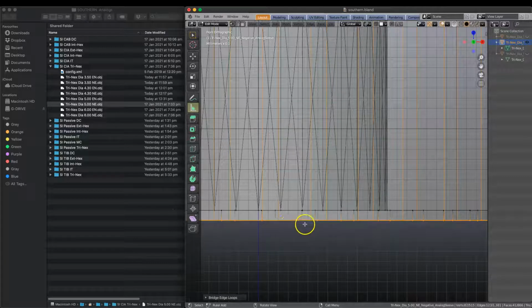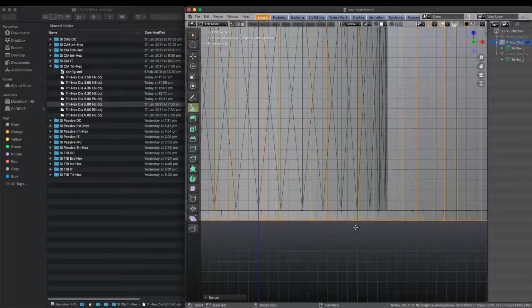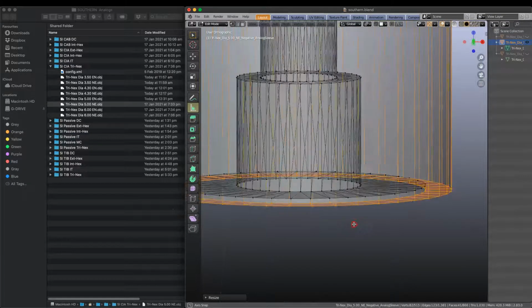So in order to make this a surface on the horizontal, we have to match these two edge loops. So to do that, while they are selected, press S, then the letter Z. We're scaling in the Z direction to 0, and then push enter. So just to recap, press S, press Z, press 0, and then press enter. So this has now averaged out the distance between those two edge loops, and it's set them both exactly the same on the horizontal plane, which means it should work.